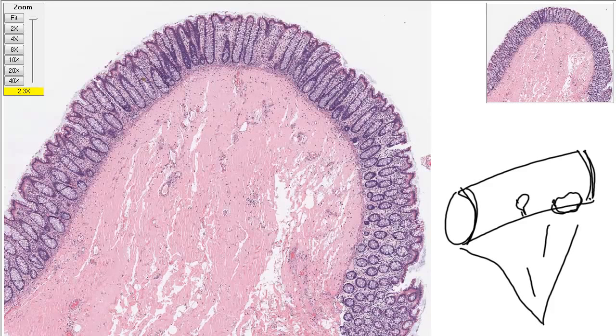Okay. So, not cancer. And then we'll find areas in which the lining is a little bit roughened, and we'll take sections of those. I see. And that can happen just from someone being allergic to food or just irritation. So just irritation in certain sites. Right. So we're going to have the areas where it's kind of irritated, some in which there's a polyp, something sticking out. We want to really look at it under the microscope. And then the thing which they were mainly worried about, the cancer. I see. Very cool. So that's what we're going to cover in the slides that we look at today.